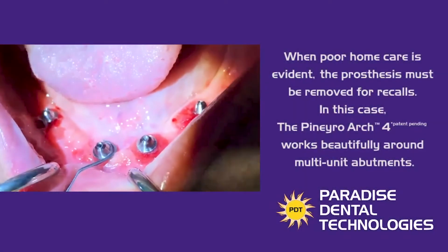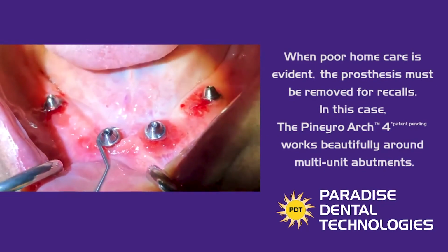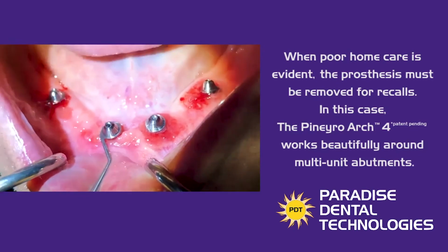When poor home care is evident, the prosthesis must be removed for recalls. In this case, the Pineyro Arch 4 works beautifully around multi-unit abutments.